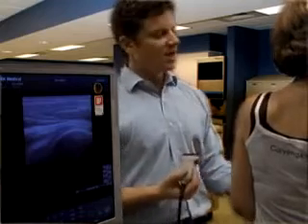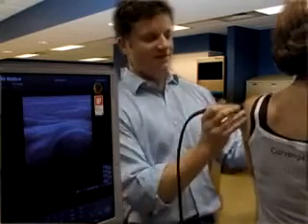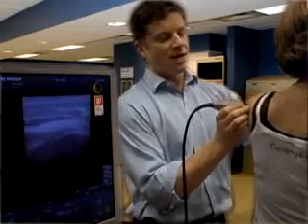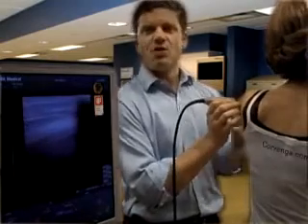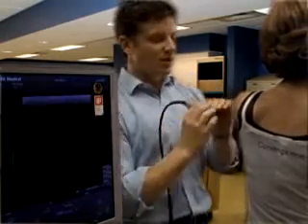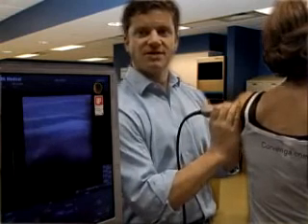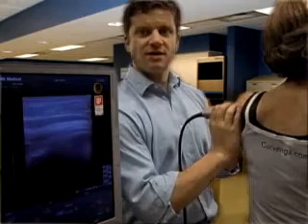Once we've identified the structures, we want to take the patient and have them grab the opposite shoulder. What this is doing is opening up the glenohumeral joint itself, making it a little bit easier for us to actually do the injection.